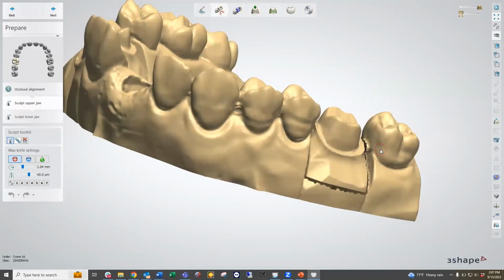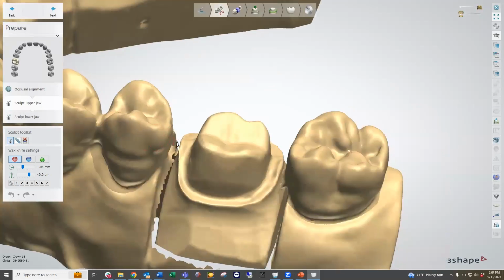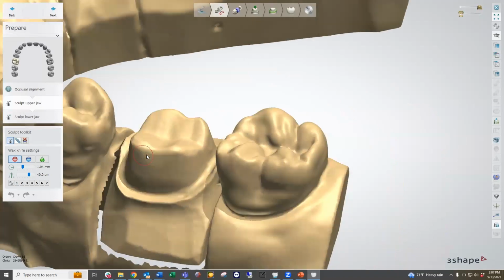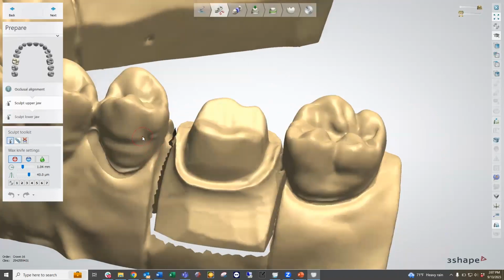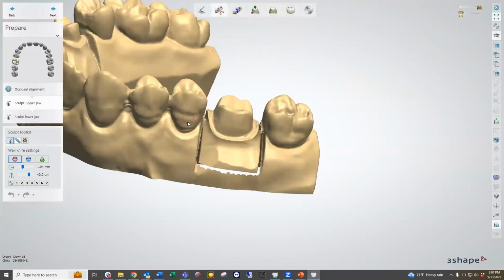The careful thing is that we don't want to overdevelop or cut into existing model textures, because that will take away from the individual design in those relative areas. So we want to keep these areas untouched as much as possible and just develop them where we need to.